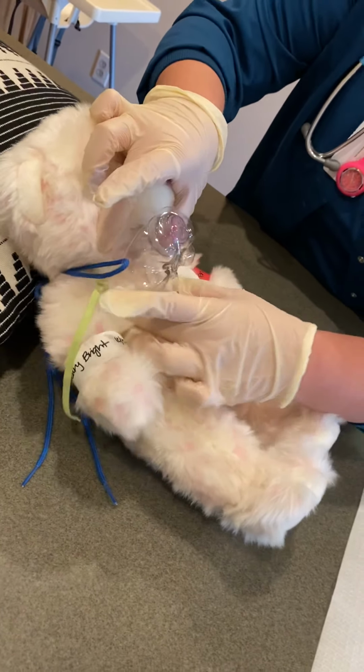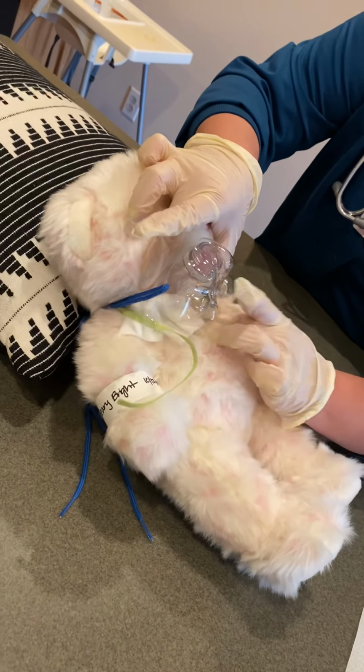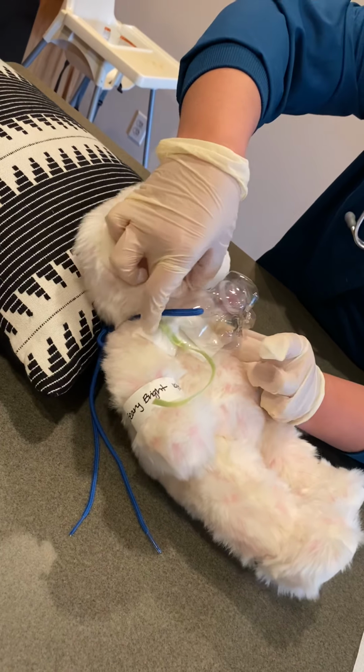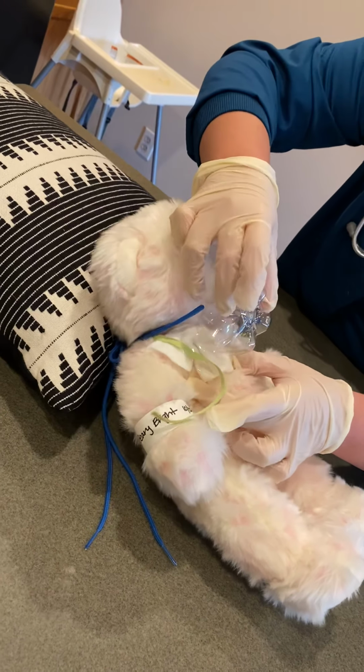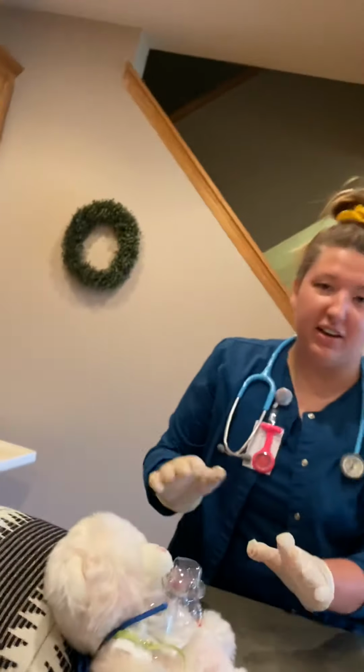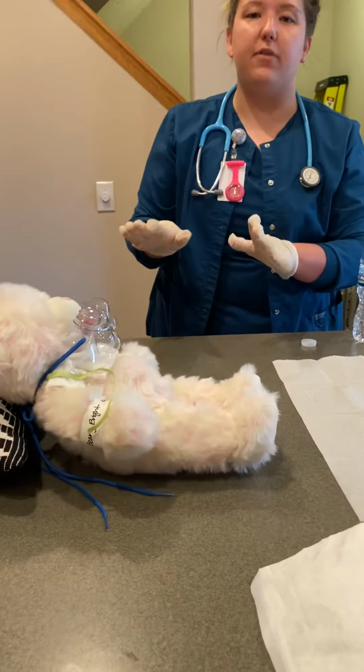as best as I can, making sure it's not bunched up here. Okay. My patient doesn't have a very good neck access, so I'm doing the best I can with that, but I would ensure that it was flat and everything was good.